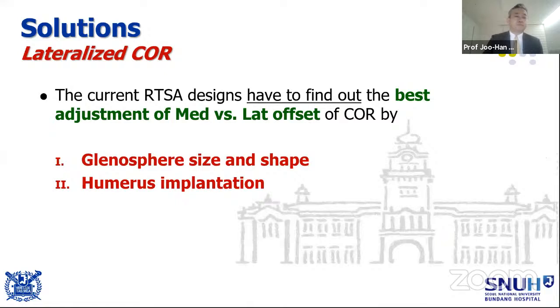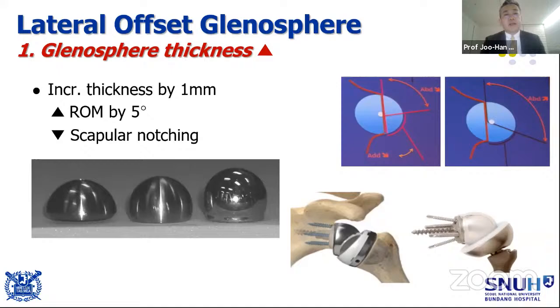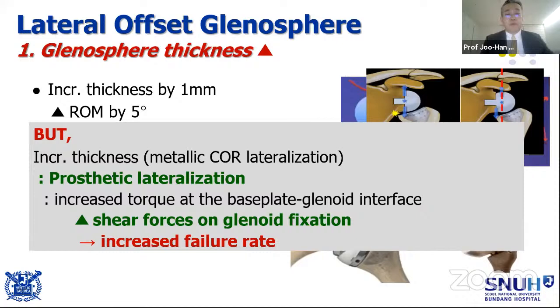So there are two ways to solve this medialized center of rotation: glenosphere or humerus. Let's talk about the glenoid first. How to make the lateral glenosphere? Number one, the thickness of the glenosphere should be increased, like two thirds of a sphere, which increases range of motion and reduces notching. But this prosthetic lateralization causes shear force on the glenoid fixation, and as you know, it can increase the failure rate.